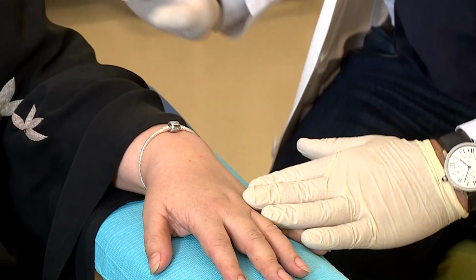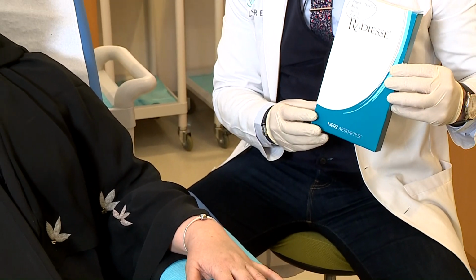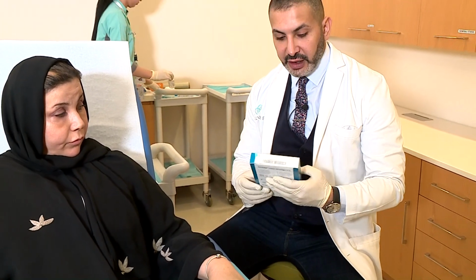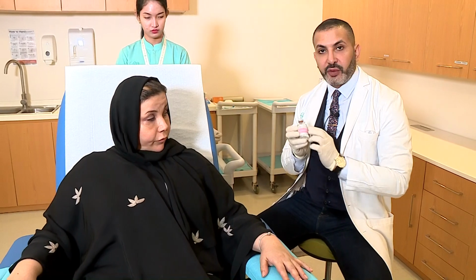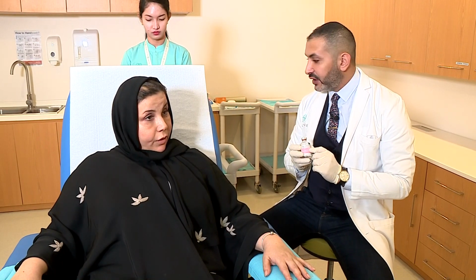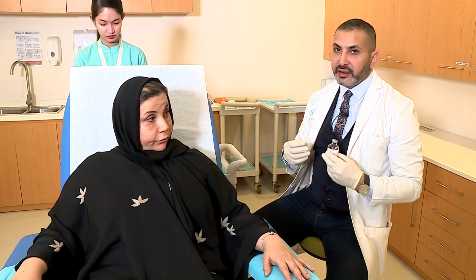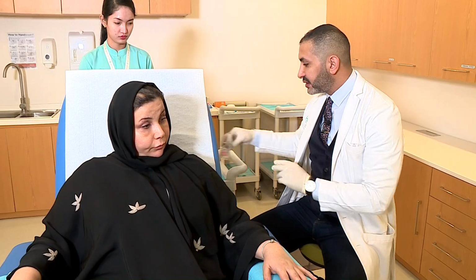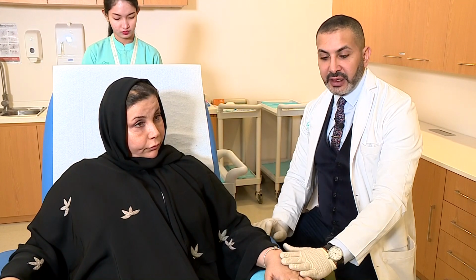The dilution of the Radiesse: when we're using the Radiesse product, the syringe comes with 1.5 ml. And the standard dilution for using the Radiesse for the hand indication is usually diluting 0.5 of lidocaine, 1% lidocaine, together with 1 cc of normal saline. This will be a total of 1.5 dilution. With the 1.5 of the product of Radiesse, it will be a total of 3 ml used for both hands.